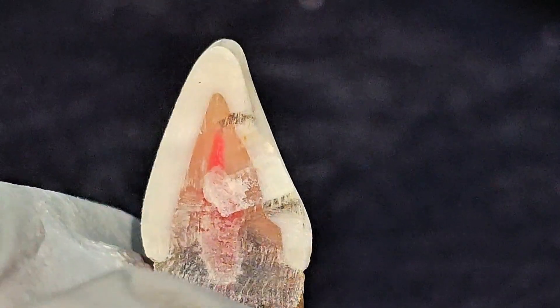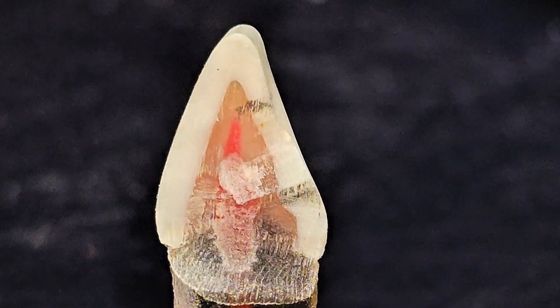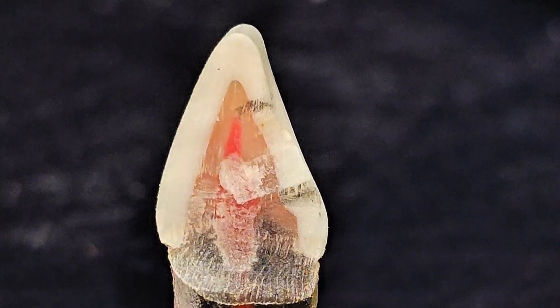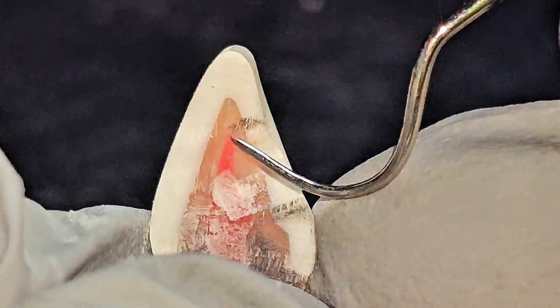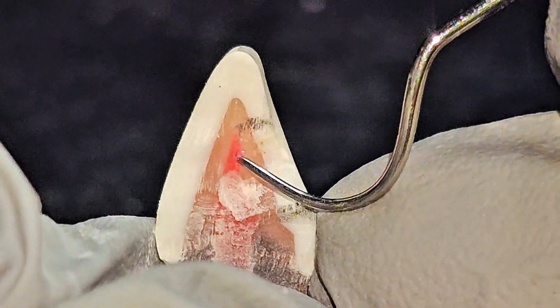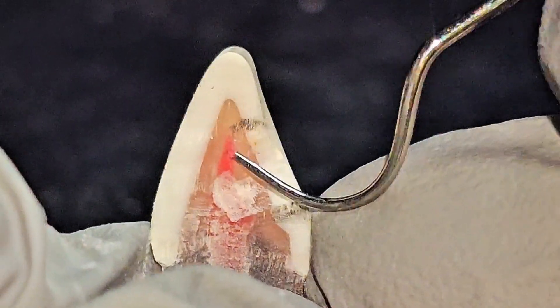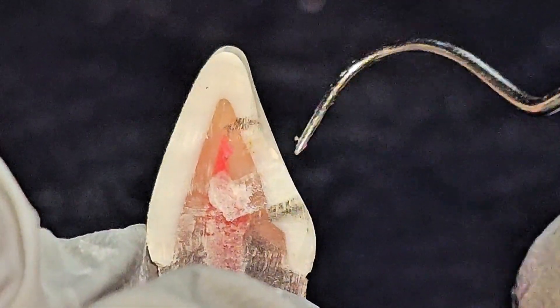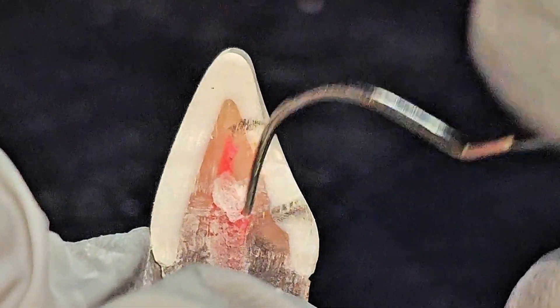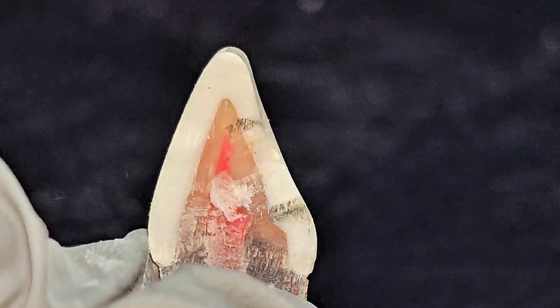At this point using the explorer, try to feel the pulp horn. Okay, I feel something there right? And also it is smooth and nice. Okay so we need to go a little bit further up.